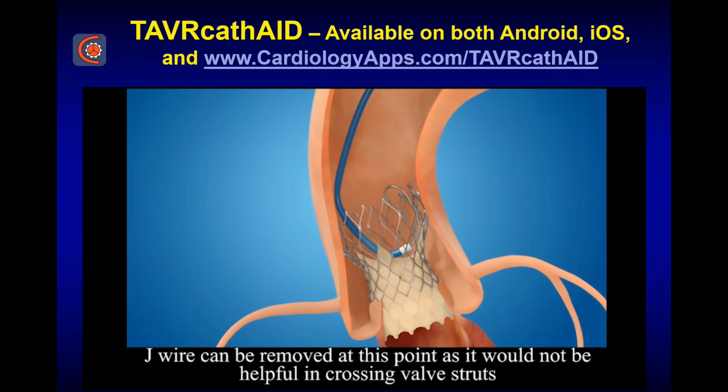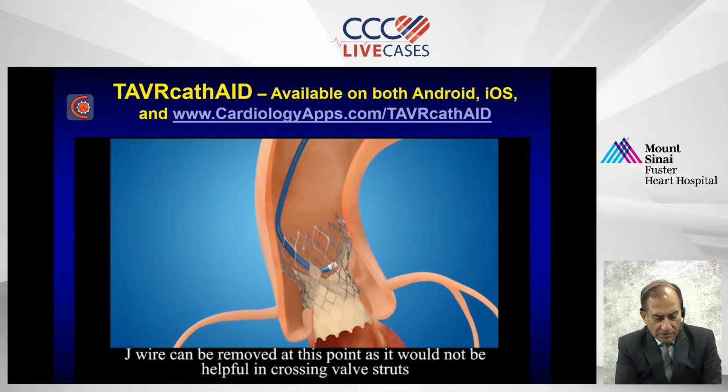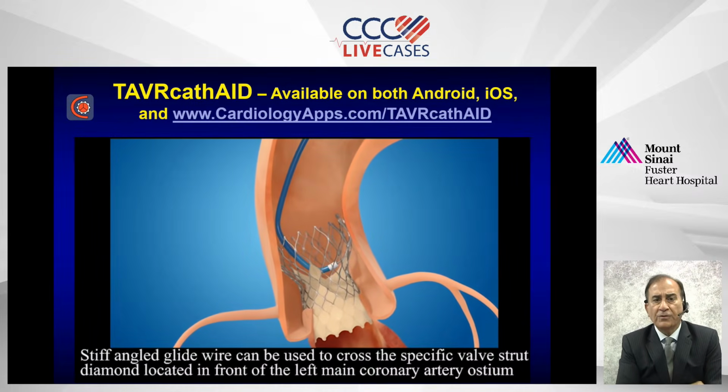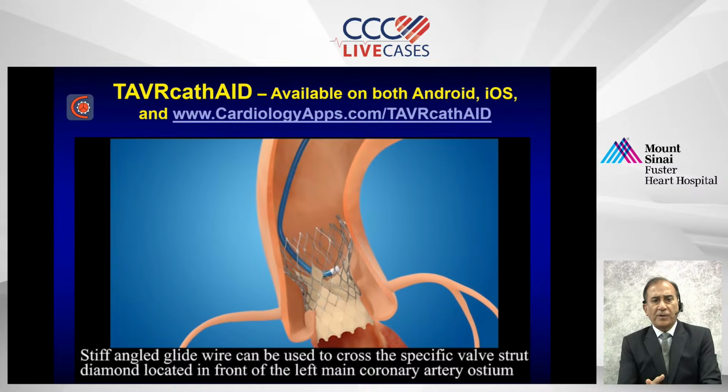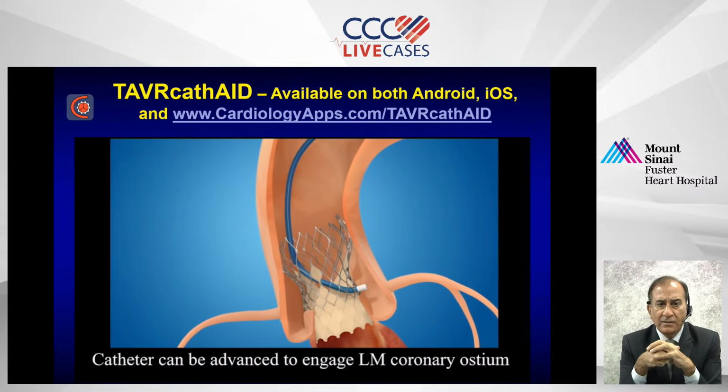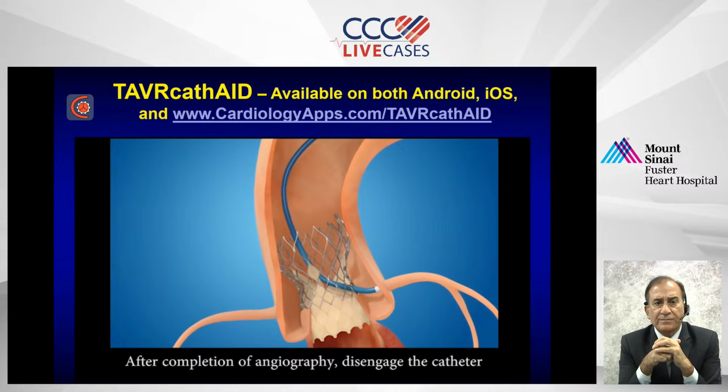A question has come. This is Dr. Mohammed El Rais, I think he's from Egypt, if I remember from before. He's asking, should you be using radial access? Would left radial be a better option?